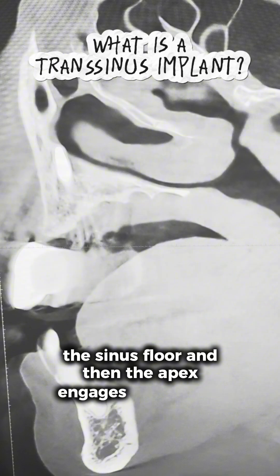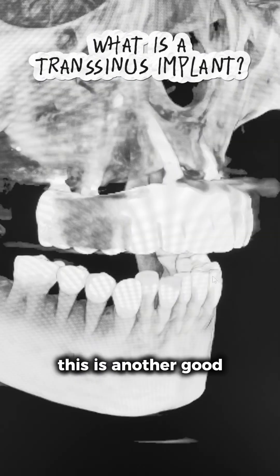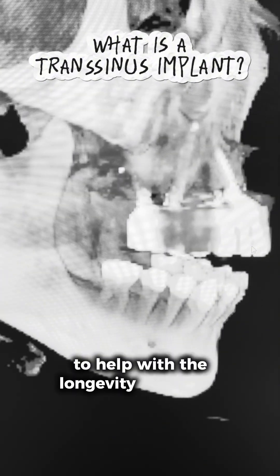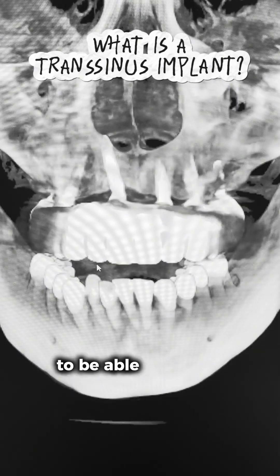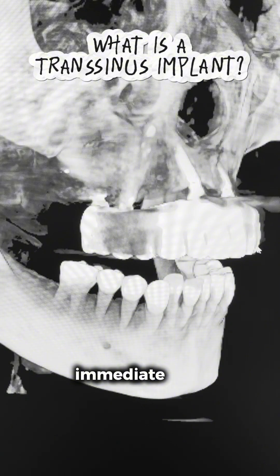This is another good way to improve the AP spread to help with the longevity of this All-on-X case. It is also another great tool for full-arch surgeons to be able to provide an increased likelihood of same-day immediate load protocol.